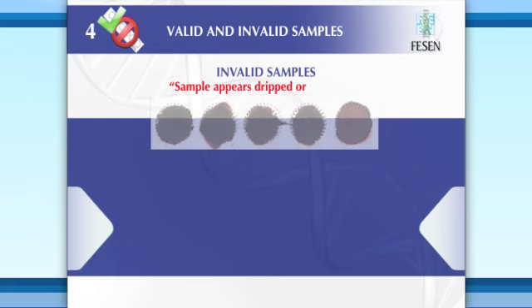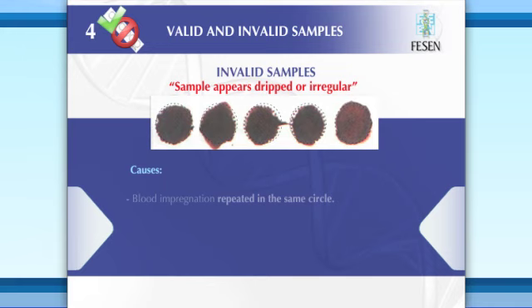Sample appears dripped or irregular. Causes: blood impregnation repeated in the same circle. Blood impregnation on both sides of the paper.